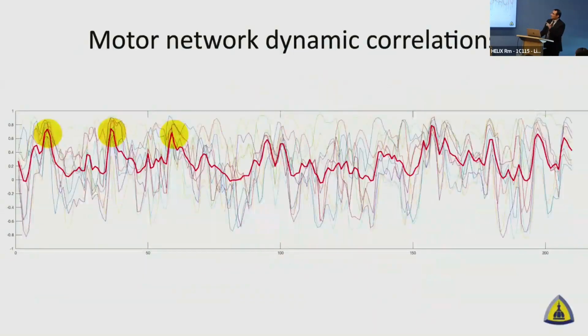And then the dynamic connectivity. So I mentioned that the length of the study that we do, 6 minutes, 10 minutes, is kind of variable, right? And in some patients, it's working out well.